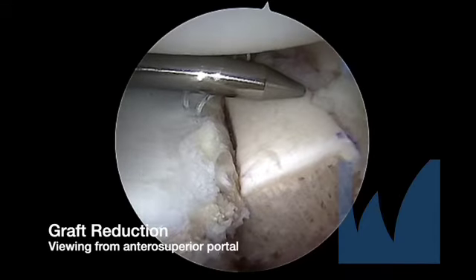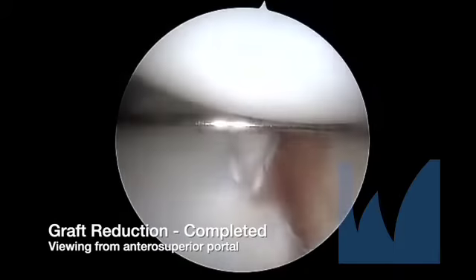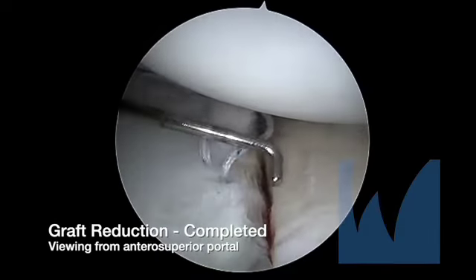A switching stick is used to guide reduction, and adjustments to graft positioning are made using a probe. The fully reduced graft shows a minimal gap at the margin, and there is no translation in response to force sufficient to bend a probe.